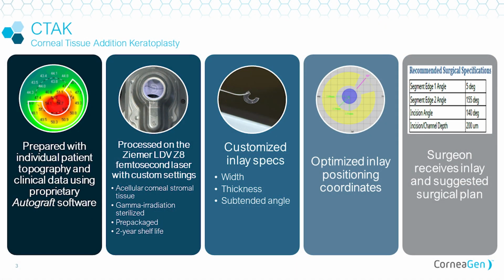So let's look at how the tissue is processed. What we do, using proprietary software that we've developed, is take clinical data and topography and tomography data and individualize and customize the tissue per the individual patient specifications.